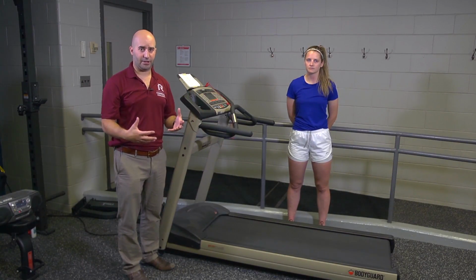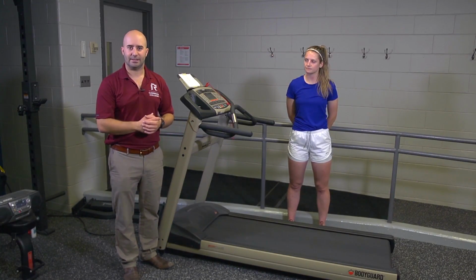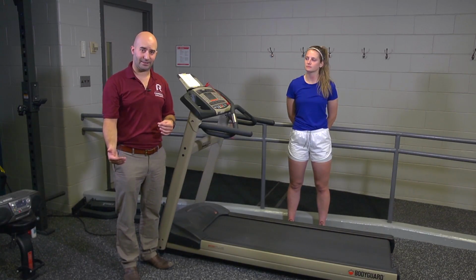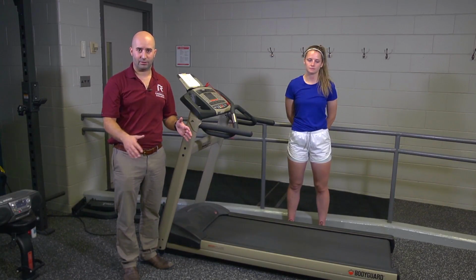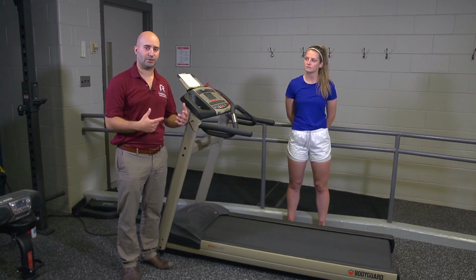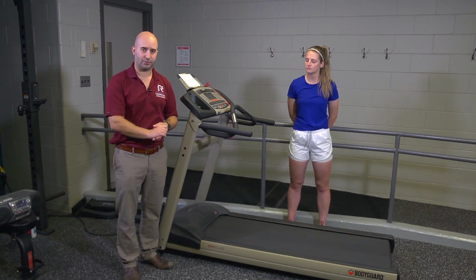So it's just another variation. This test for the client is probably physically the easiest test for them to complete out of the 3 tests that we'll be seeing within the lab. So once again, if you have a client who's quite unfit or maybe has joint issues, here it's walking only. There's no jogging, so it's easier on the joints. Once again, with the ergocycle test, that one's good for your joints as well, but if the person's not used to being on a bike, they might find it quite difficult, so this might be a more appropriate alternative.